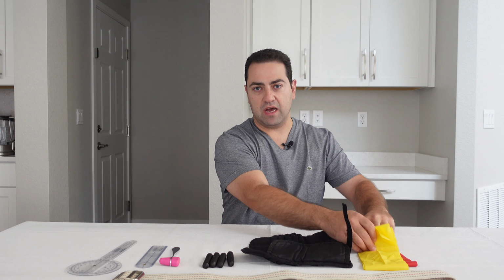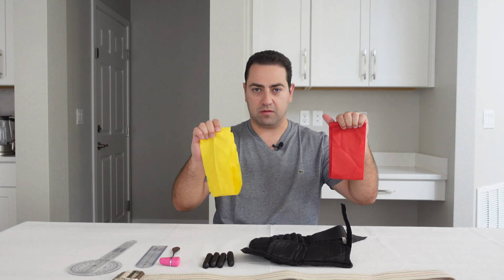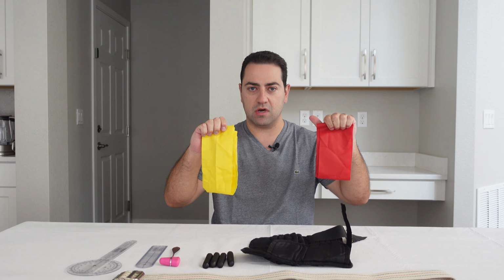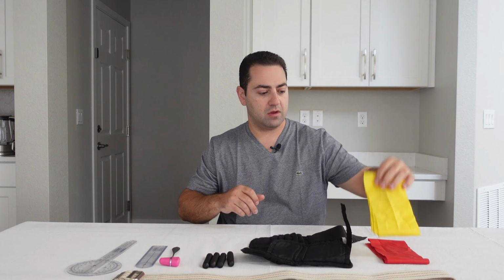I always have elastic band in all colors, but only keep yellow and red elastic bands in my bag because most of the geriatric patients I work with typically are unable to tolerate any resistance level greater than yellow or red. I do, however, have every available color in my car just in case.